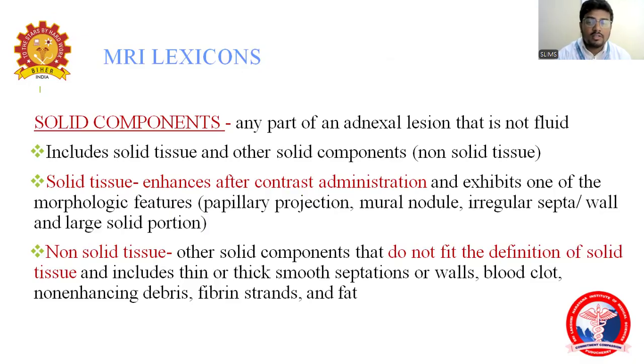A non-solid tissue is any other solid component that does not fit the definition of solid tissue, and it includes thin or thick smooth septations or walls, blood clot, non-enhancing debris, fibrin strands, and fat.